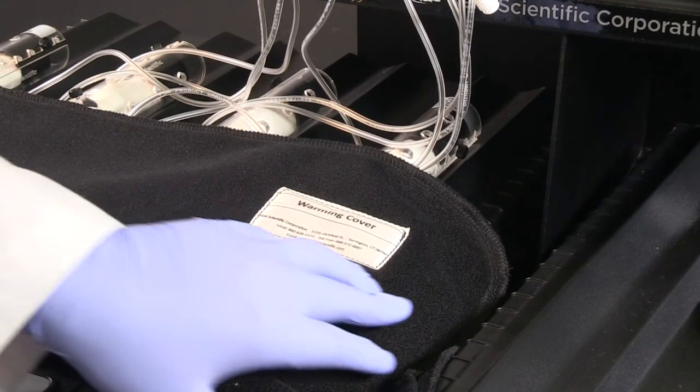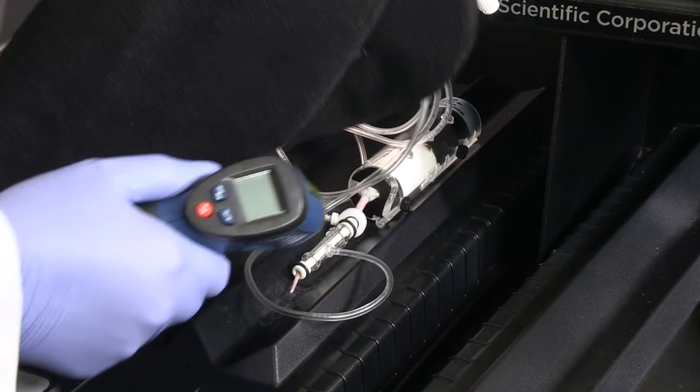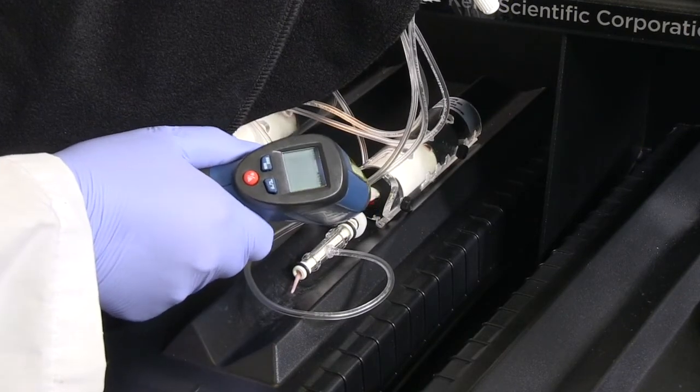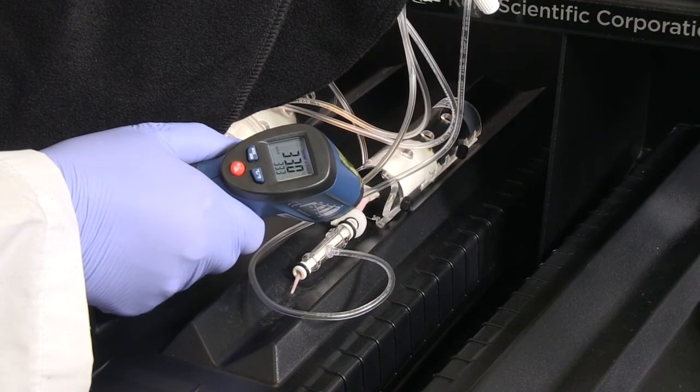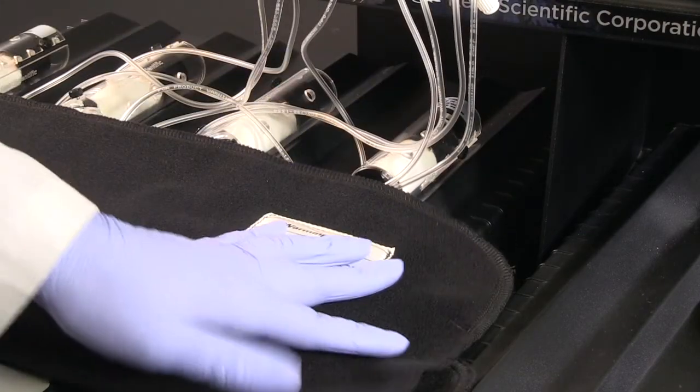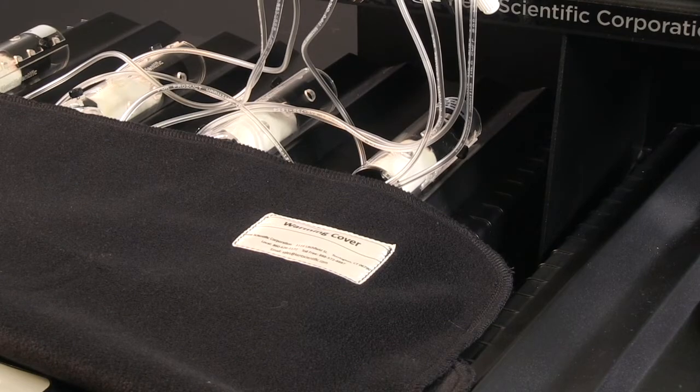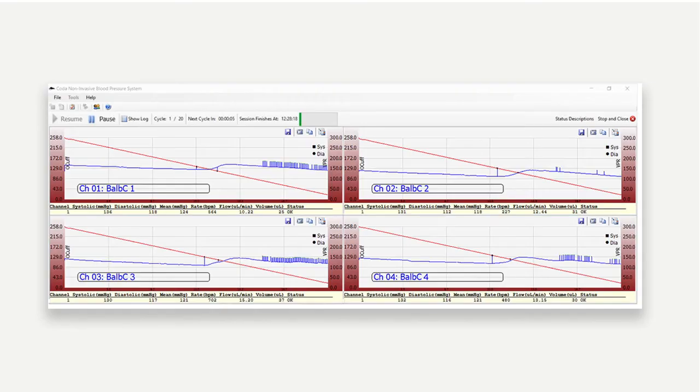Now that the software is set up, verify that your animals have sufficient tail blood flow by measuring their tail temperature. Point the far infrared thermometer at the base of the tail. The tail temperatures should measure at least 32 to 35 Celsius to ensure optimal conditions. Once the tail temperature is in range, you can begin measurements.